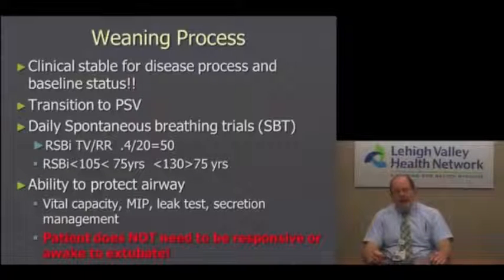Secretion management. If patients have a voluminous amount of secretions and they have marginal weaning numbers and marginal pressures they can generate, then they are at risk again to have retained secretions or to stay on the ventilator. So with secretion management, if patients have lots of secretions but they have a strong vital capacity, a strong MIP, then we don't worry about it too much. However, when they have lots of secretions and marginal numbers, then we have to worry about it.